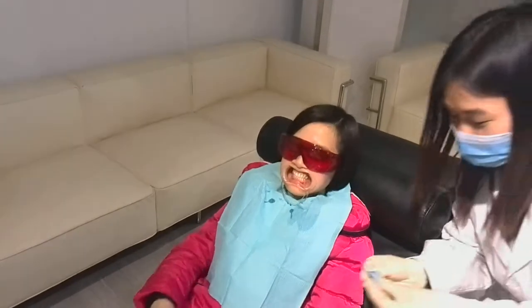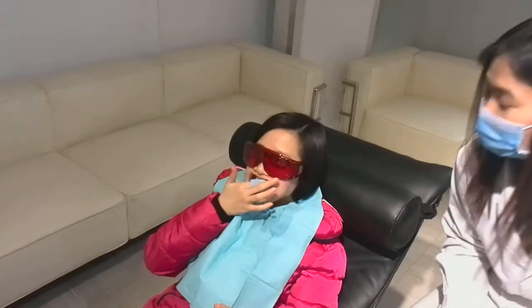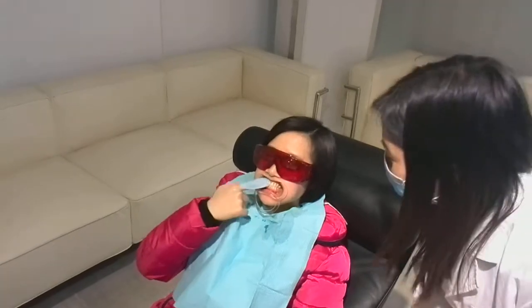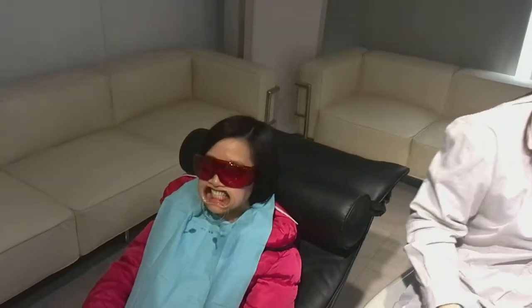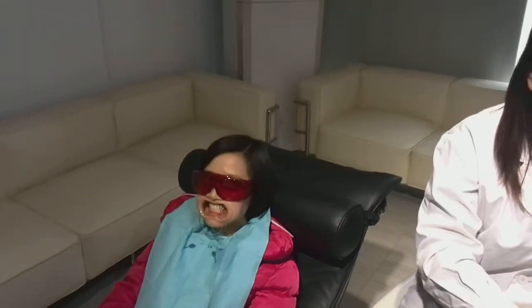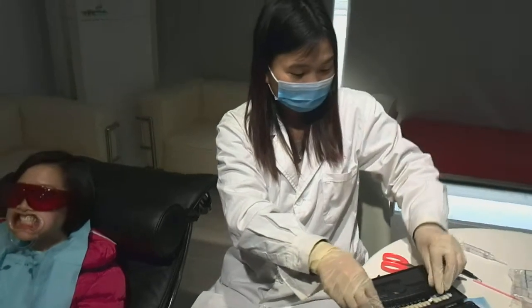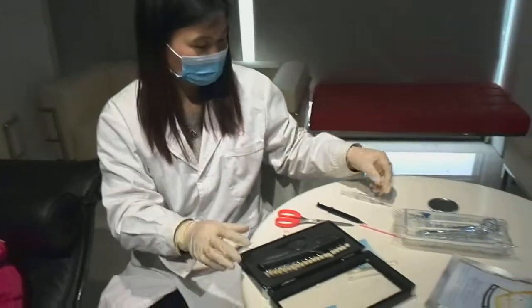Third, provide the patient a teeth wipe to clean up the teeth. Use the shade guide to compare with the teeth, and take a photo and make a record. After the preparation, it's time to put on the whitening gel.